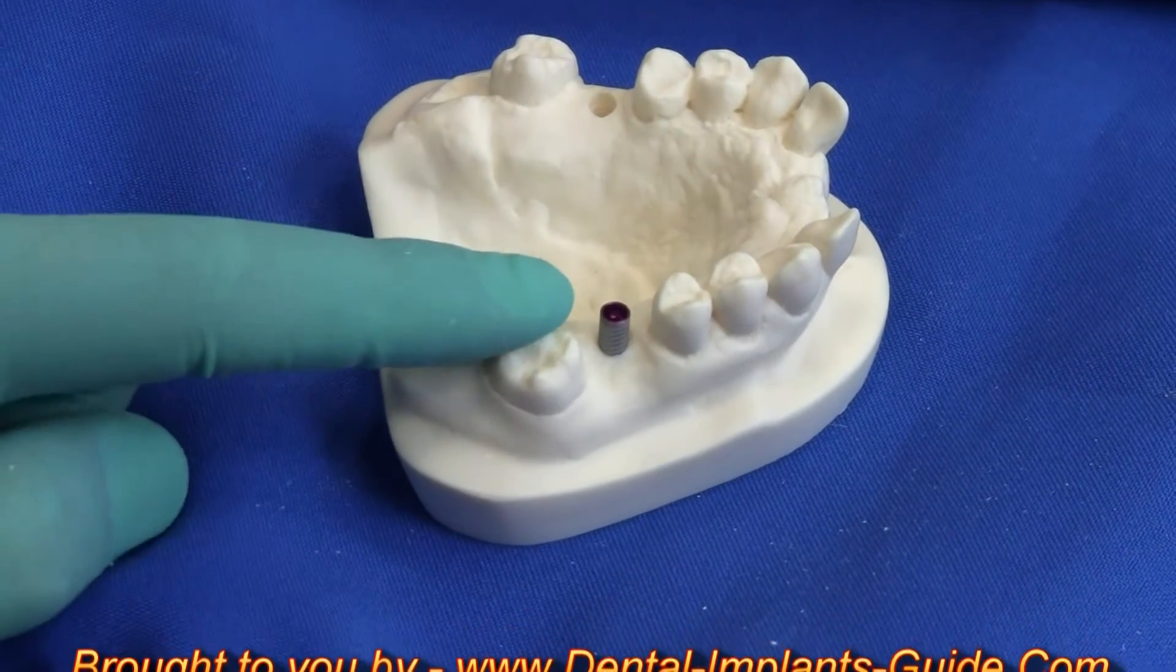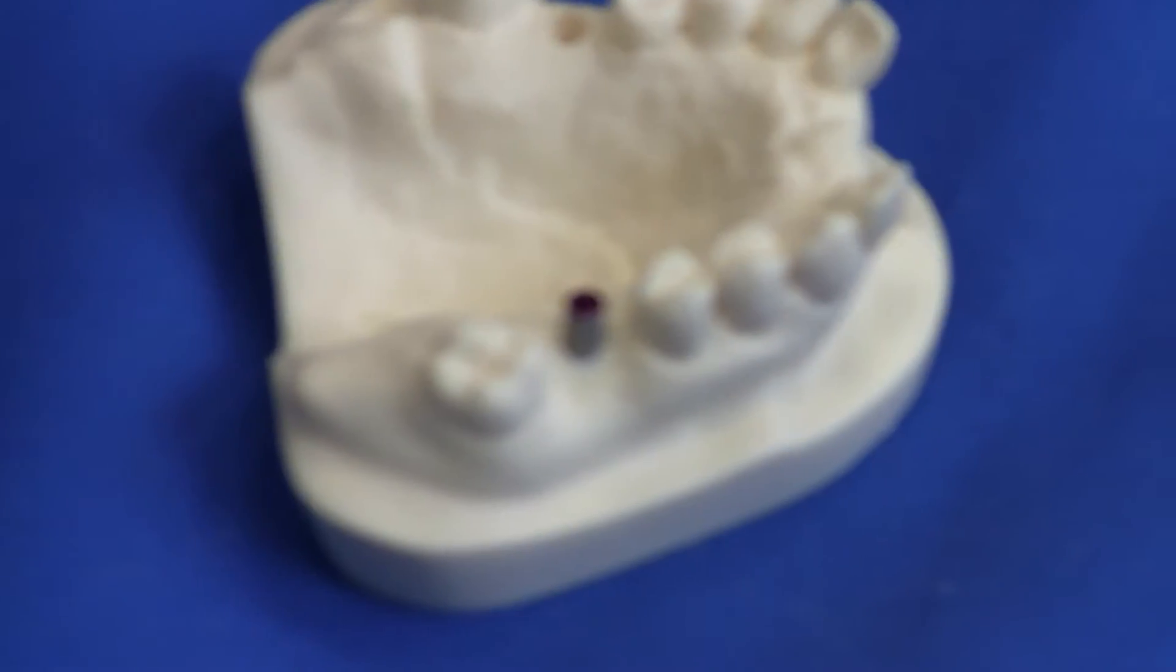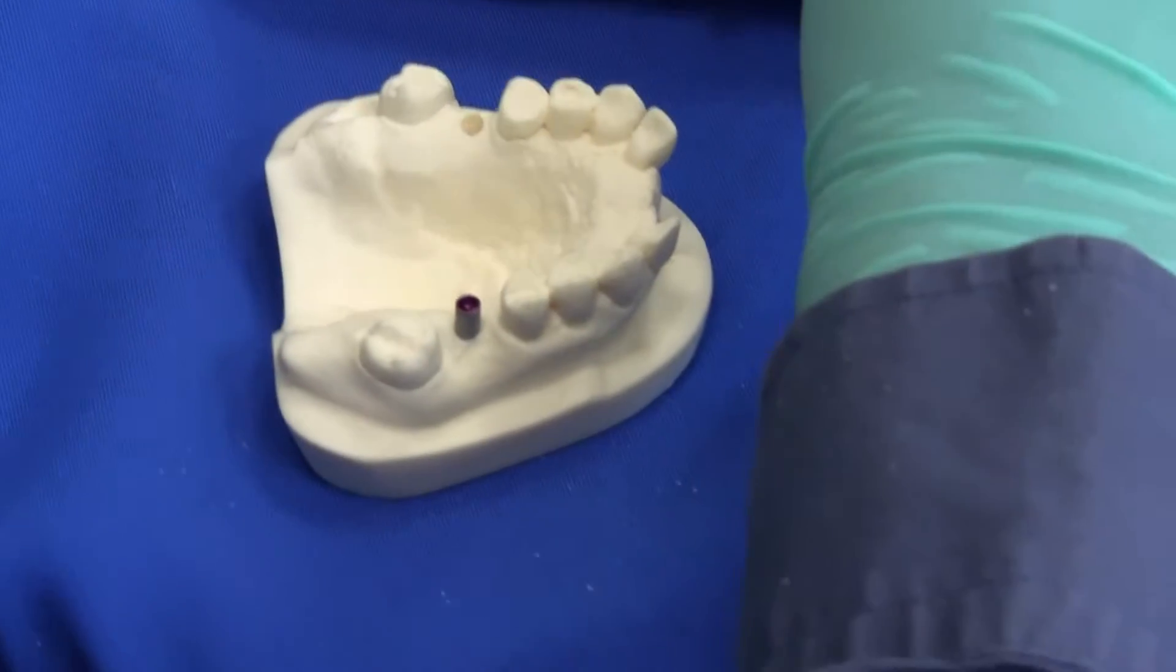Now that the implant is placed and reached at least 35Ncm, I'm going to finish placing it with the ratchet wrench.